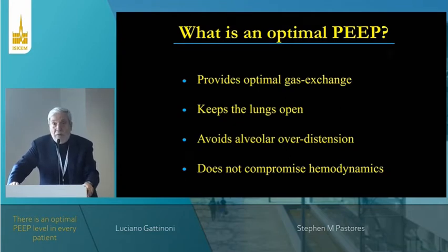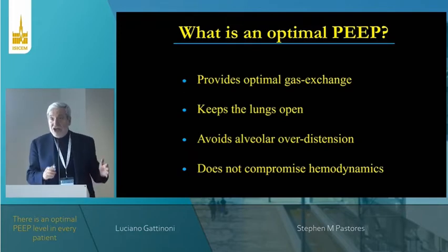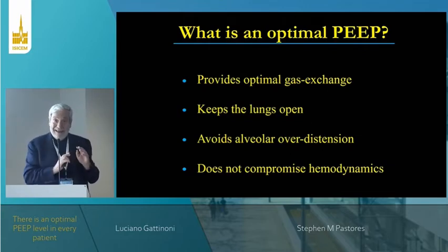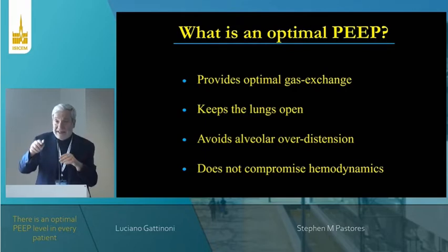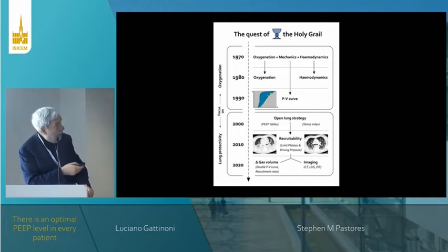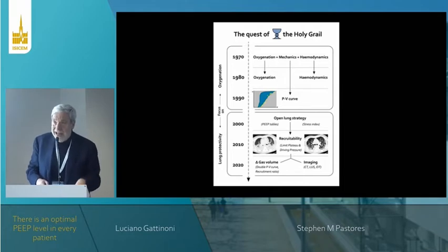PEEP is always a compromise. And I appreciate that now Marcelo shifted from keeping the lung open whatever it costs to: wait, be careful, there may be some overdistension and maybe some collapse on the other side. And it is a first step on a long way. But let's see. Apparently today we found the Holy Grail.